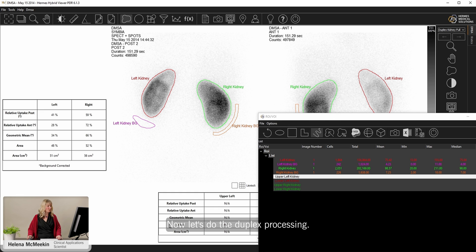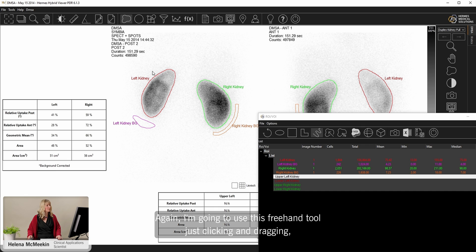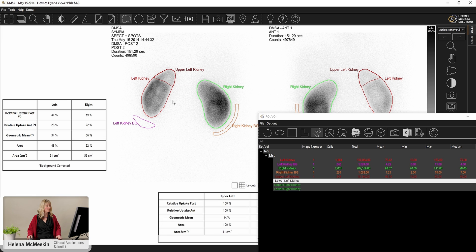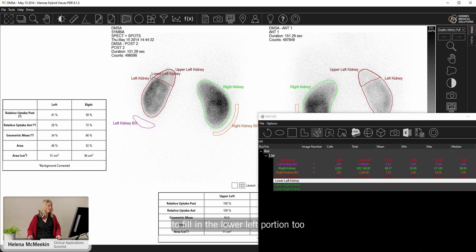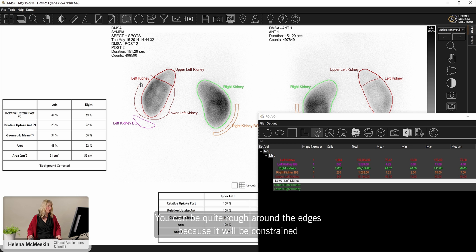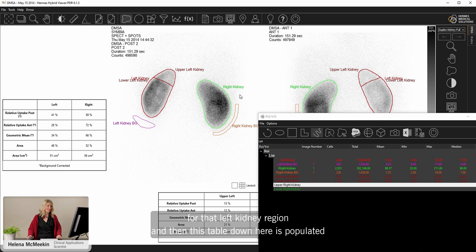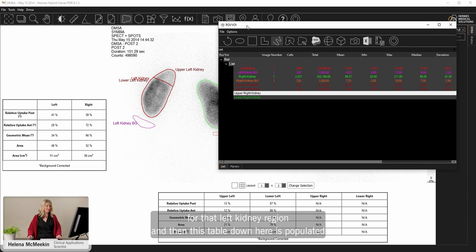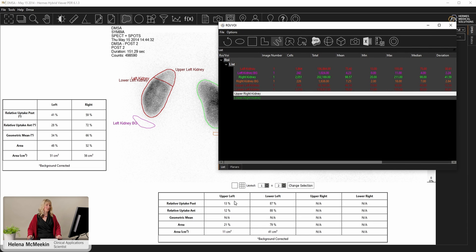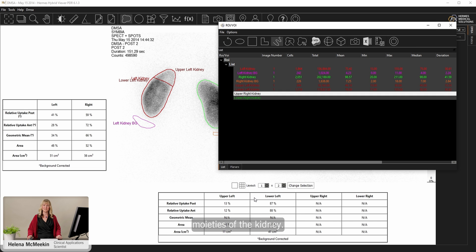Now let's do the duplex processing. So we have an upper left kidney option here. Again, I'm going to use this freehand tool. There's clicking and dragging, defining the split for the duplex there. And then also just to fill in the lower left portion too. So let's try and make that along there. You can be quite rough around the edges because it will be constrained by that left kidney region. And then this table down here is populated with the portion of the function in the upper left and the lower left moieties of the kidney.